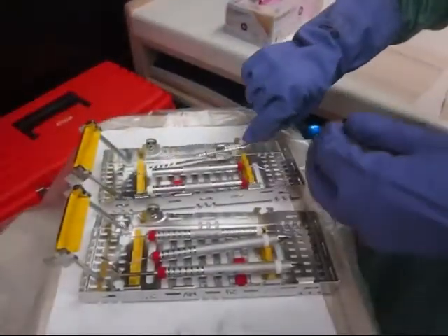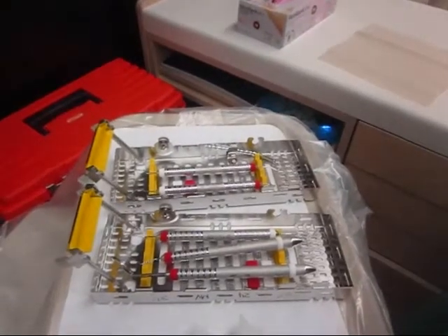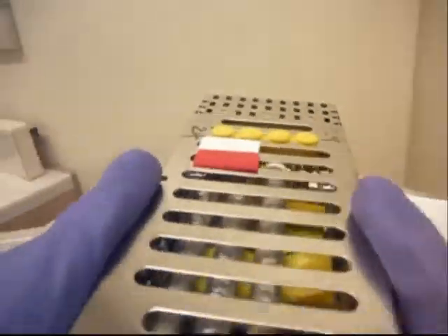She secures her air-water syringe firmly. Oops, Frances, you forgot to throw away your indicator strip — we don't want to clog up the Miele. Now Frances can secure her instruments, close up her cassette, and walk carefully to sterilization.